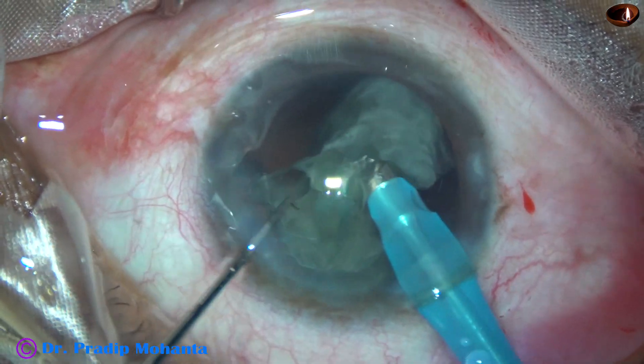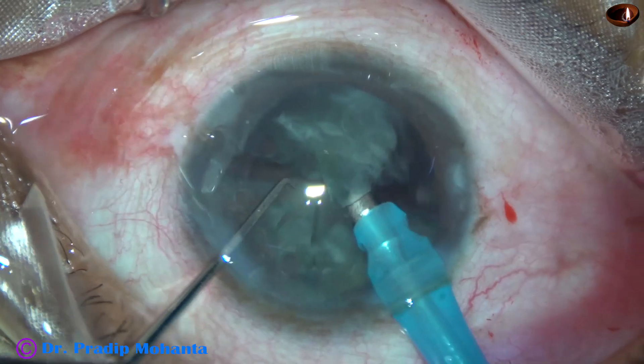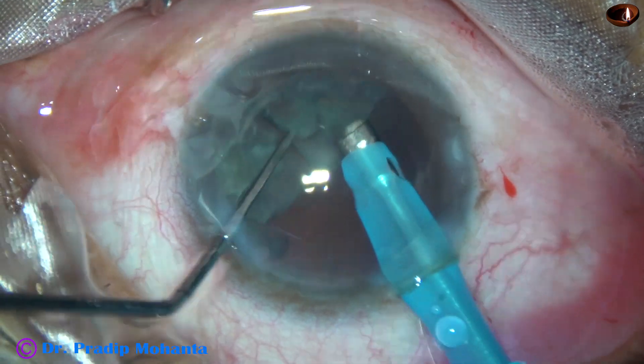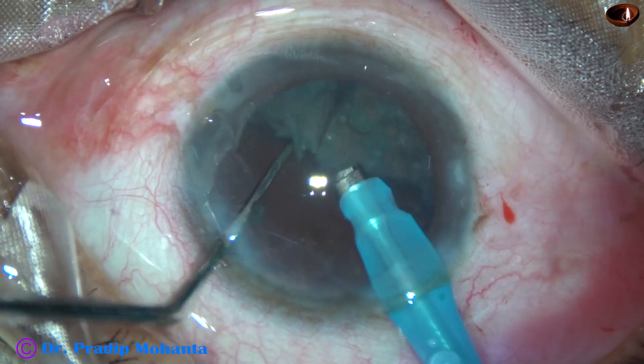So far you are in FACO mode 1, where the vacuum and flow rate are very minimal — vacuum was about 50 to 80 mmHg and flow rate was 20 to 25 ml per minute. And now with FACO mode 2, where the vacuum and flow rate are higher, the pieces are emulsified.